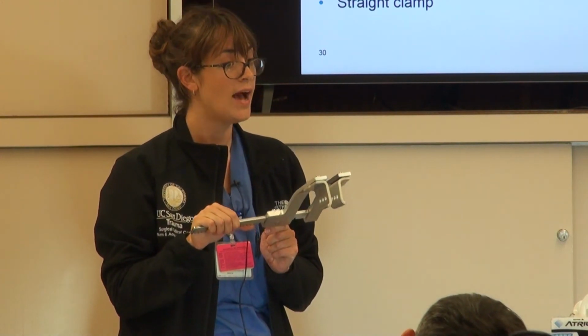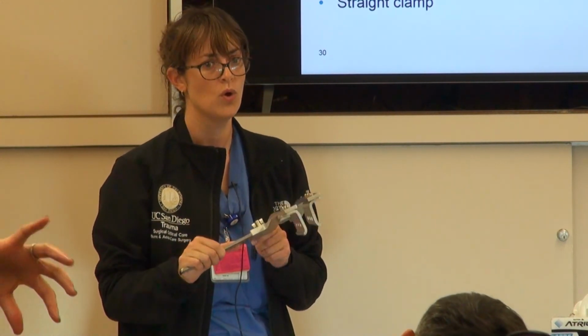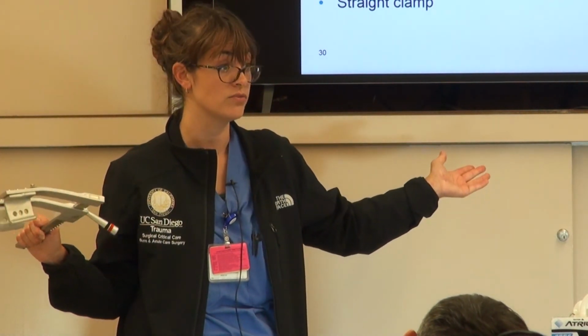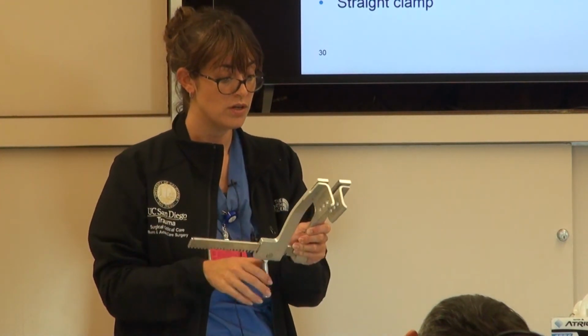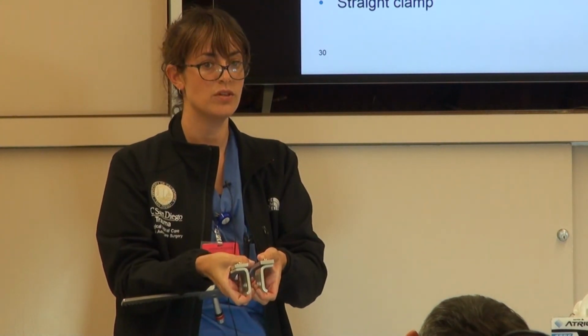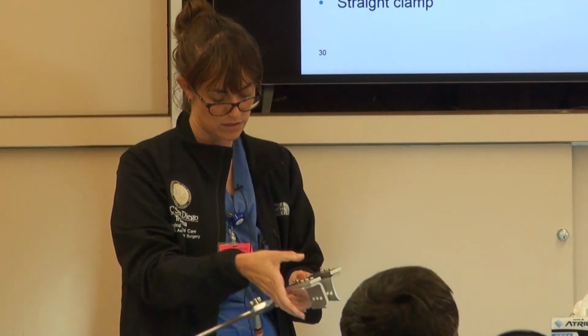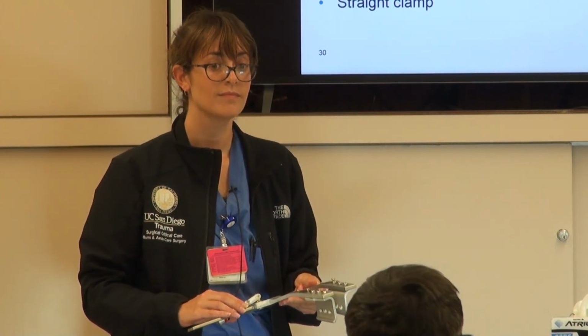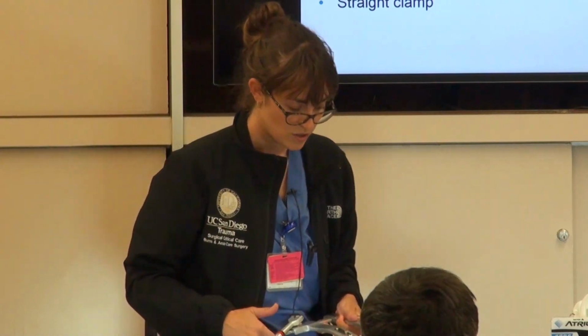The residents don't know how to put them on because they do this less frequently than you guys. How often do they get to see a left thoracotomy? Once a year, once in an entire 5 years of training, maybe. So they're not going to see it, and you guys are the best eyes and ears to fix it. We have open chest trays and then we have the retractors and the different things.